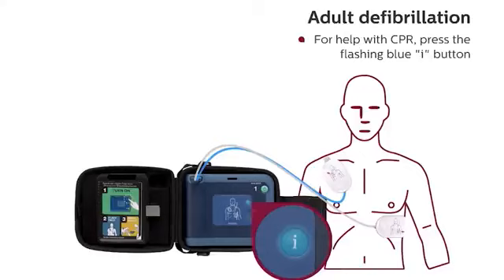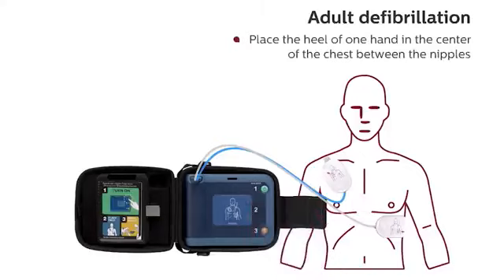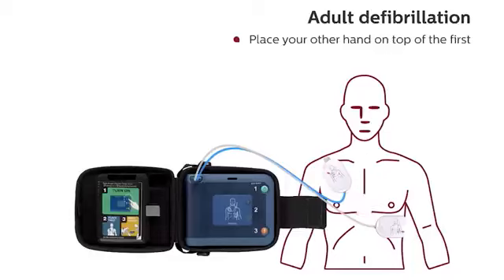For help with CPR, press the flashing blue button. Begin CPR. Place the heel of one hand in the center of the chest, between the nipples. Place your other hand on top of the first. Push the chest down firmly two inches. Keep time with the beat.